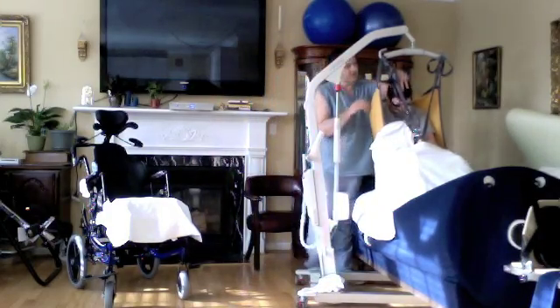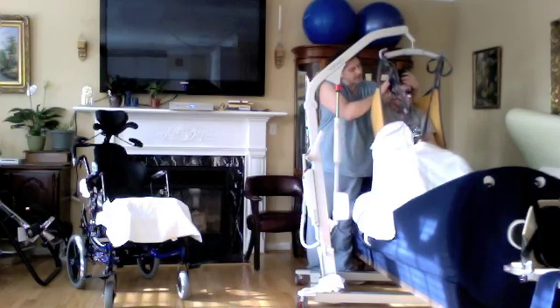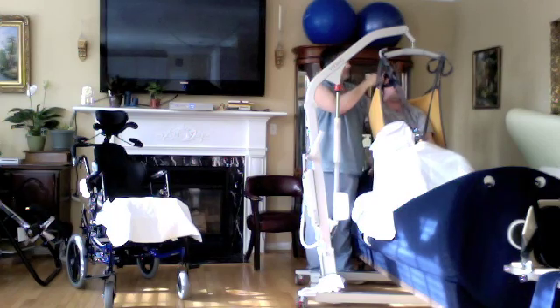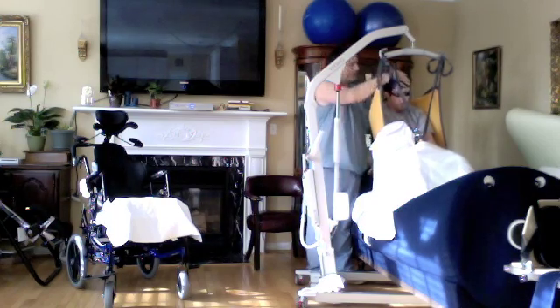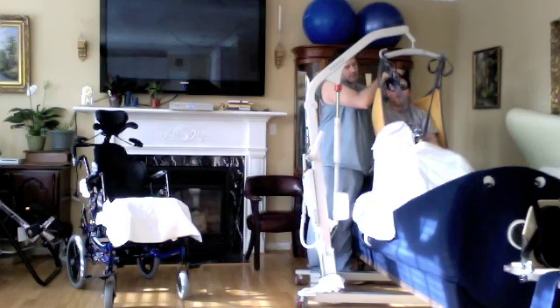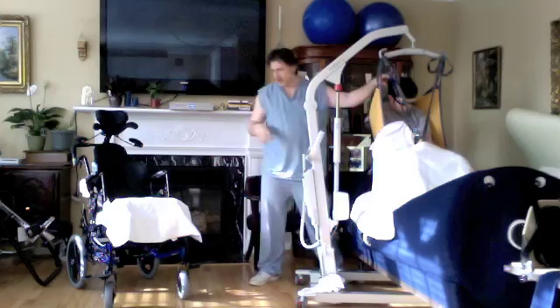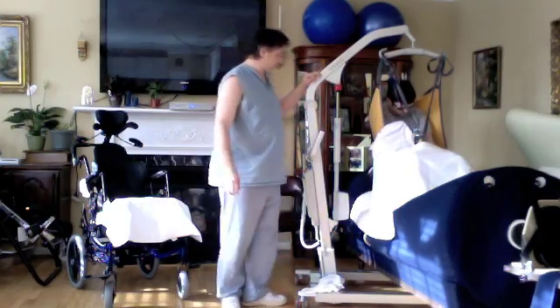Okay, right, I'm going to lift your head. This is the oxygen mask. I just slipped that off over his head. You can see we have his goggles on him. We wear them most of the day, but it's particularly important in the chamber because the oxygen can dry out the eyes.